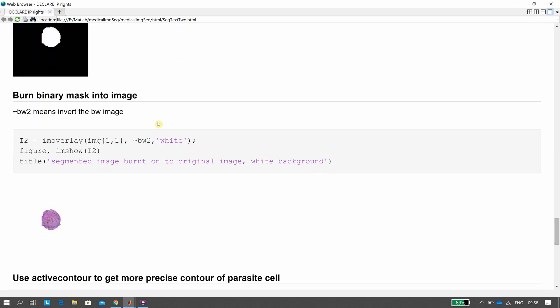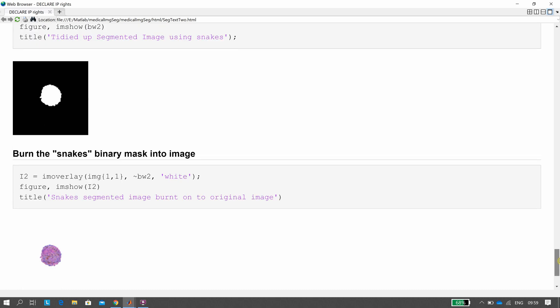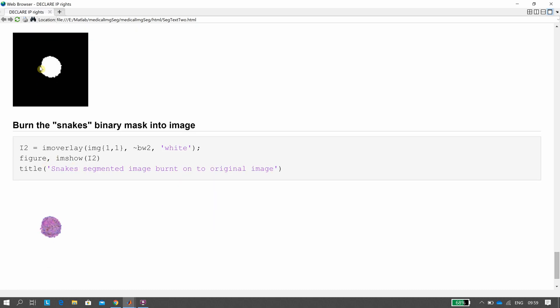Kay then burnt the segmented image onto the background but made the background white, so you just see the plasmodium. IM overlay — that's how you do it in MATLAB, how you burn one image onto the other. He then used active contours to get a more accurate estimation of the edge. If you're new to this, you may also see active contours called snakes, which gives a better understanding of how active contours work. He then burnt the active contours boundary onto the original image and made the background white, so you only see the plasmodium.